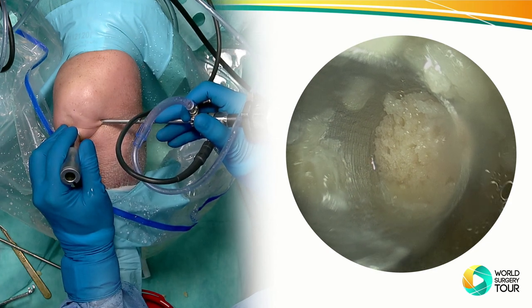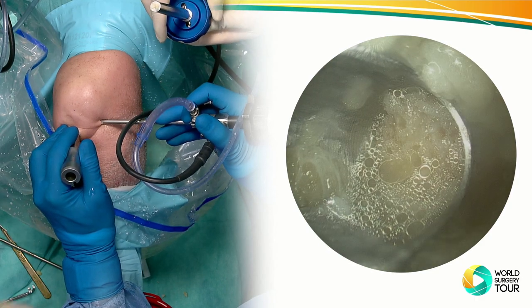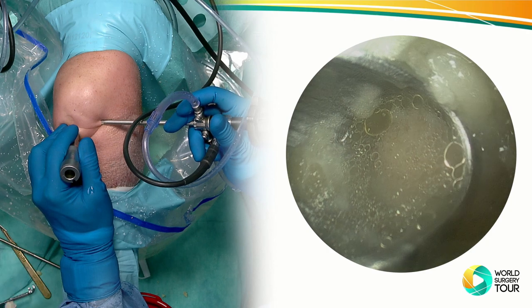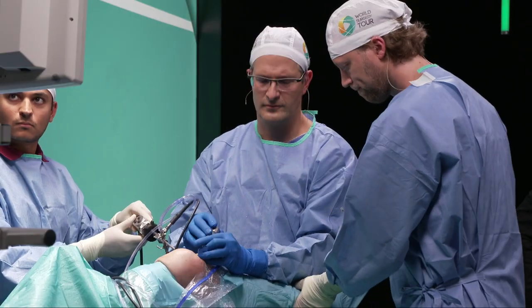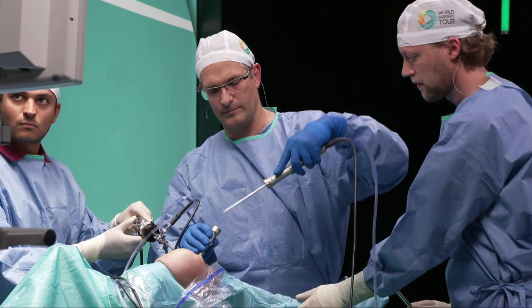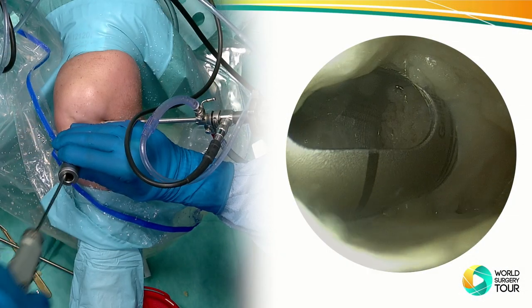And now comes the AMIC cartilage construct. Can you insert? Wait a second. Can you hold the camera for a second? See, there's a little fluid there. I'd like to remove that first. Okay. Careful. Good.